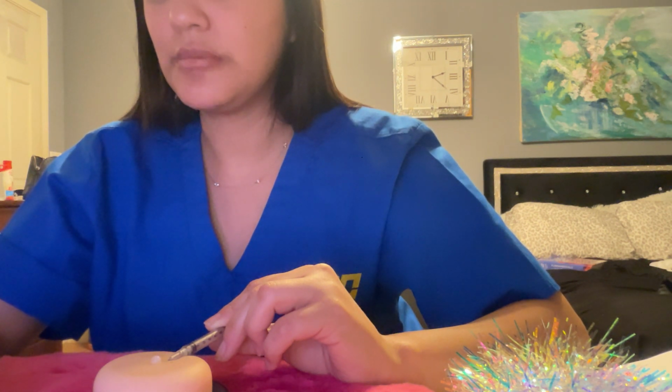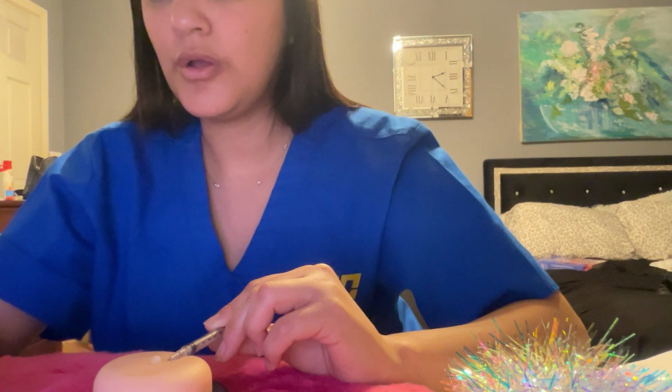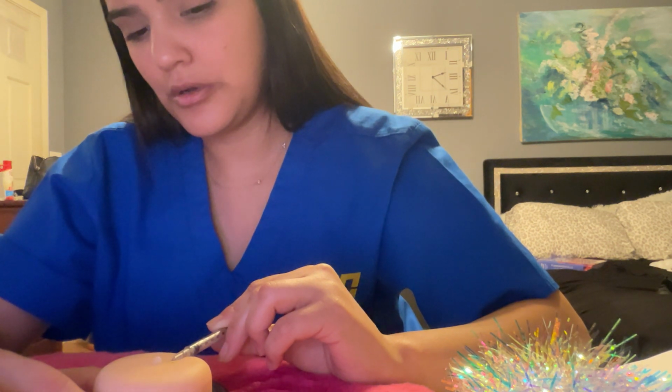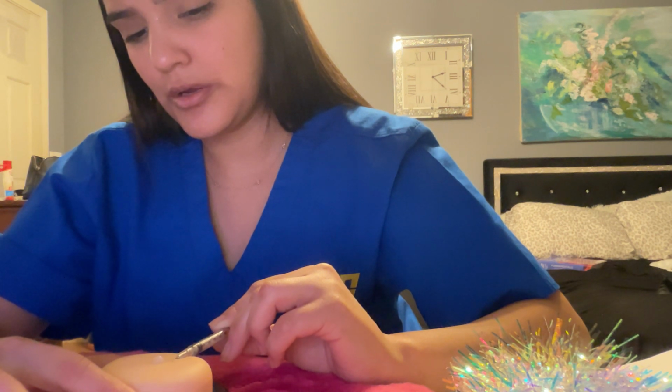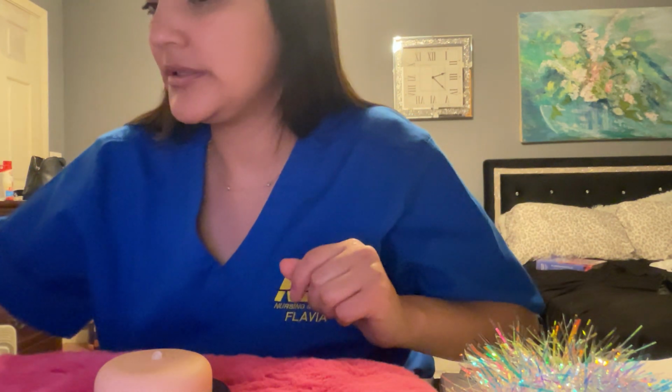Just like that. And then you want to remove the syringe at the same angle that you inserted it. Immediately you would activate the safety using one hand, so I'm just going to remove it. Just like that. And likewise, I'm going to use the scoop method and prop it back up. After that, you would discard the syringe in a sharps container.